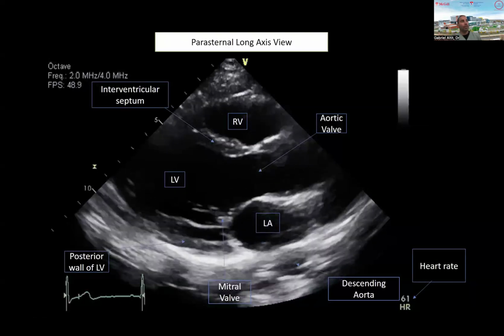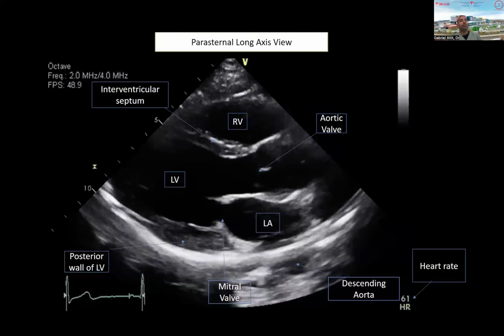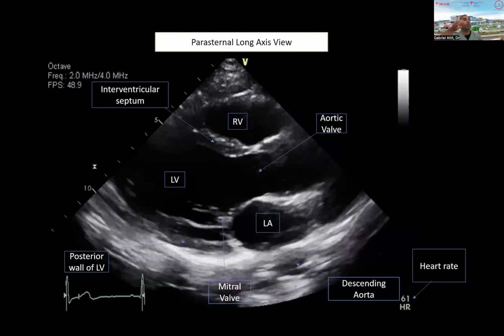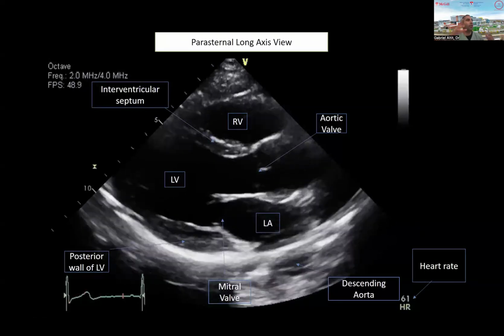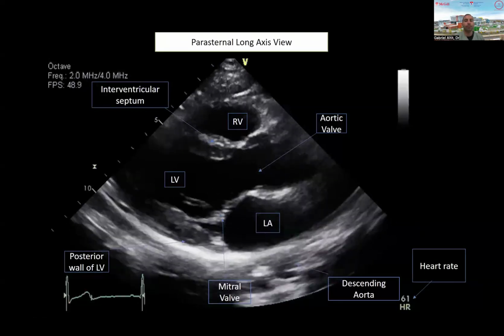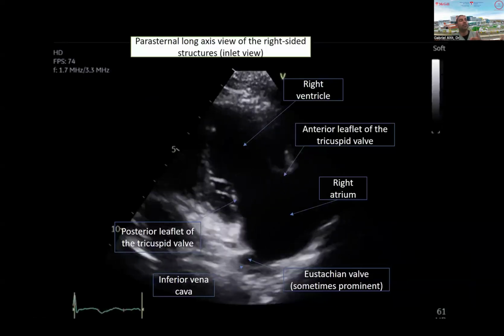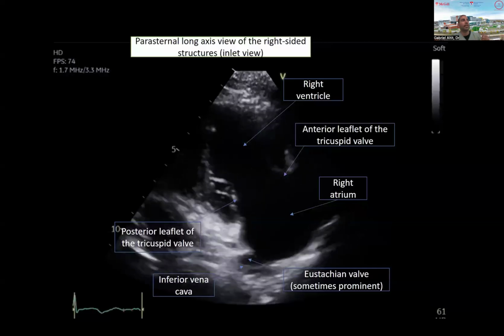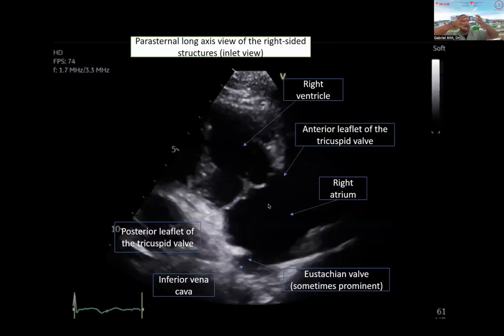And if you see our patient we delivered this afternoon and you do the TGA scan, you're going to see that there's mitral pulmonary continuity. The pulmonary valve doesn't have a conus anymore because it comes out of the left ventricle and it sits in the position of where the usual aorta would be. And typically, these patients have what we call a subaortic conus because the aorta is coming out of the right ventricle in TGA. Does that make sense? Conus is like a cone of muscle. So that's what we call conus. So it's like sitting under.